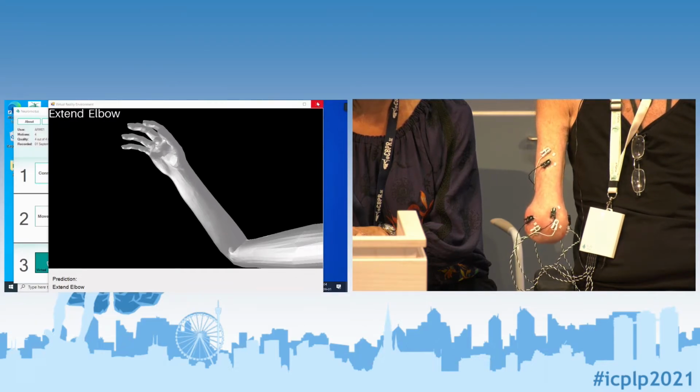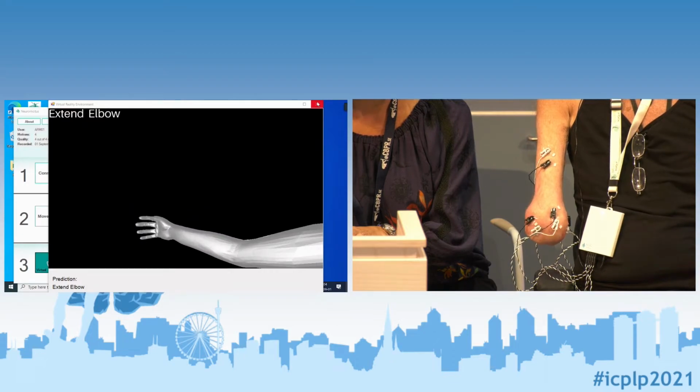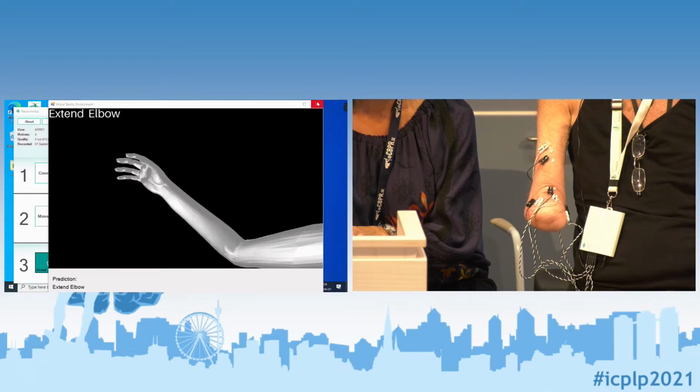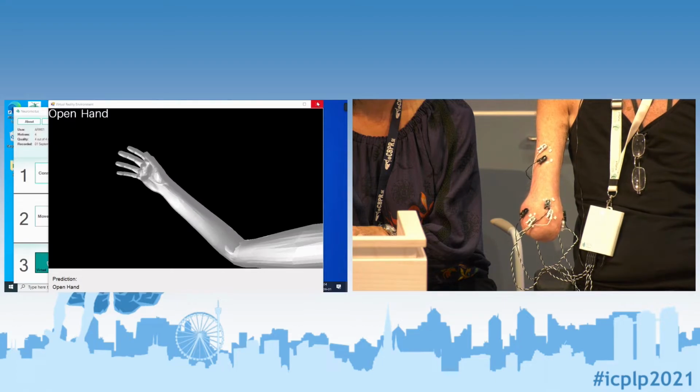So with him we can move forward to simultaneous movement, and you can see a little bit of that here. Because we want to challenge him, we can probably do much harder movements and try distal movements such as fingers.